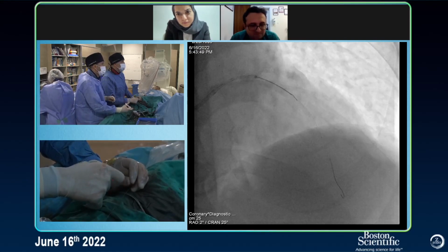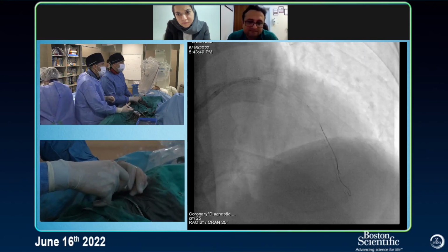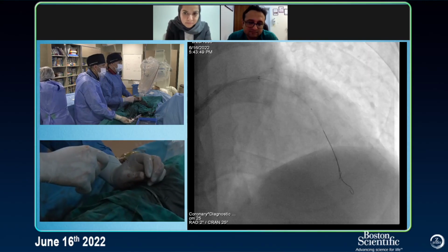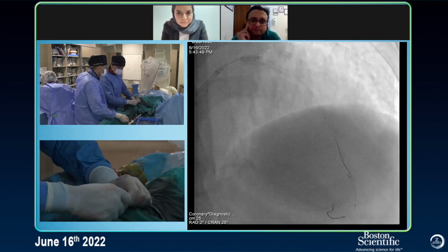Yes. That's important, that I follow the true lumen. I might lose it easily. That's why we shouldn't use a hydrophilic wire here. All right. Yes, very nice.